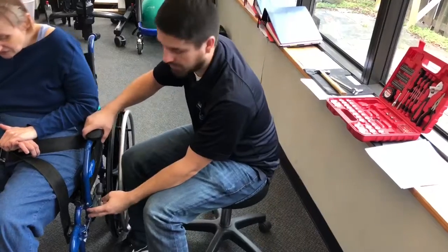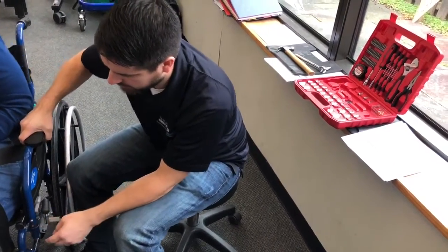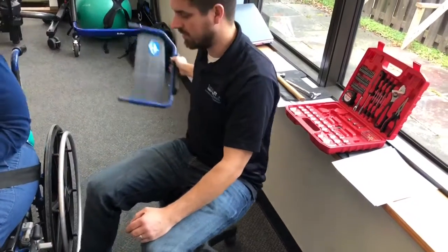Most armrests are going to come off too. There's a little button right here that we're going to press in, and this one pops straight up and then we'll remove.